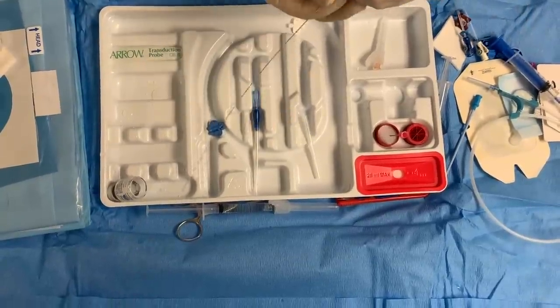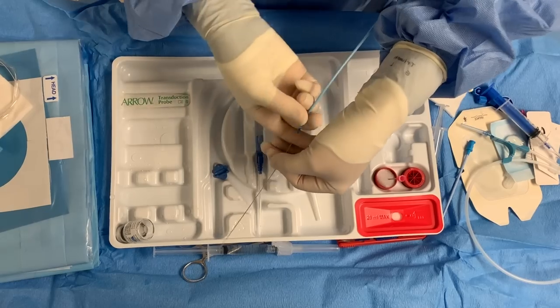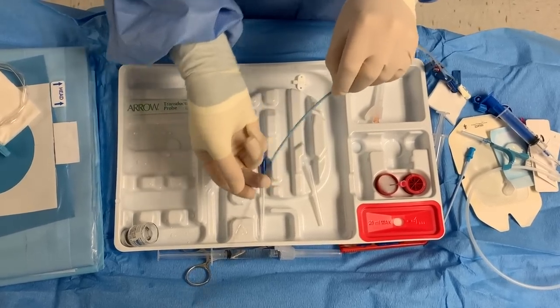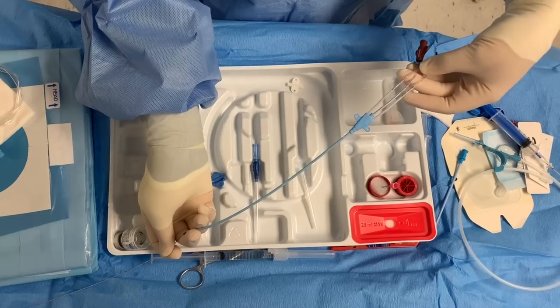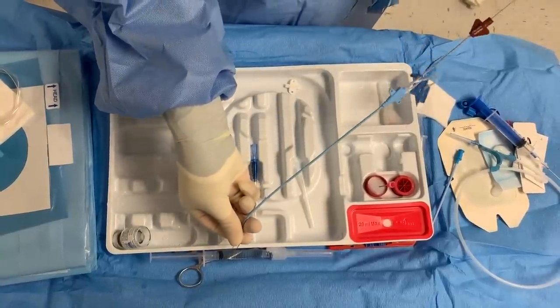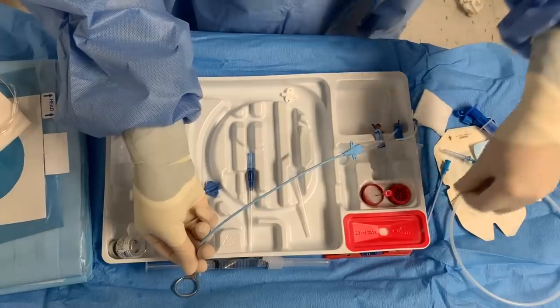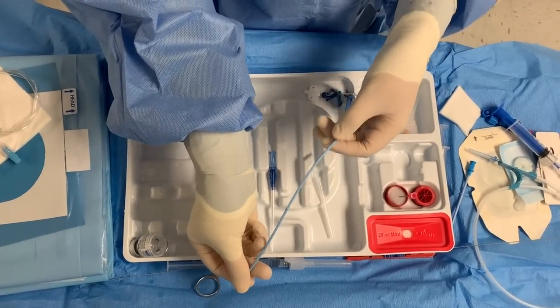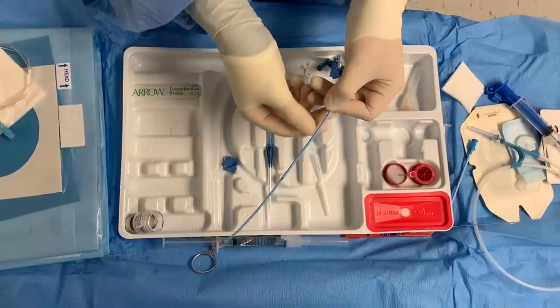Then you're going to put your catheter in there, guided — and you don't want to let go of your wire. As you go in, you're going to see your wire here. You want to see it all the way. Once I see my wire, I'm going to hold the vessel and pull the wire out — be very careful when you pull it out; you don't want to splash anybody because it's coming from blood. Now your guide wire is completely out. You have marks here and you want to be at about the 15th mark.